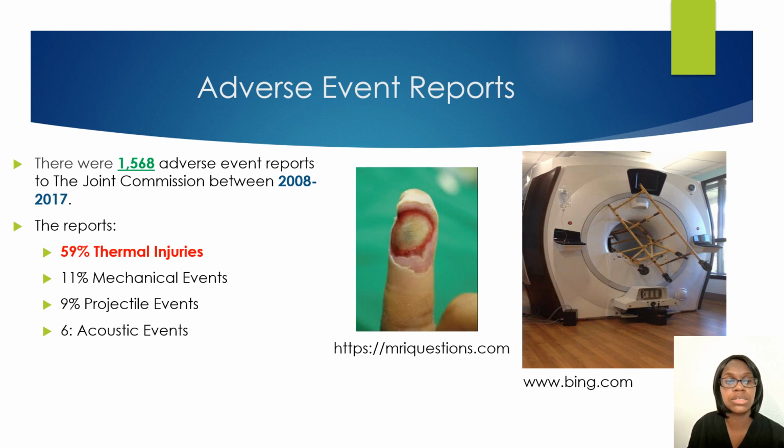So you just want to make sure that you are checking your patient, especially if you work at a hospital. Make sure they do not have that device on their finger that can monitor their pulse rate or their heart rate. So you always want to make sure that you are removing any leads and any device around their finger. And if you do have to monitor someone, make sure you use the MRI safe vital sign equipment.